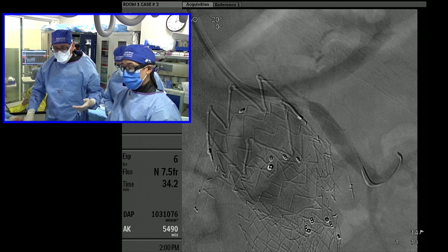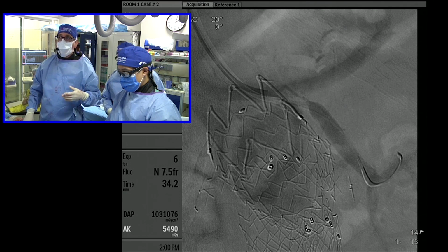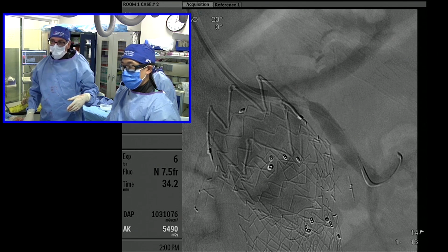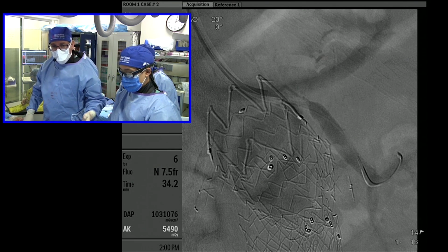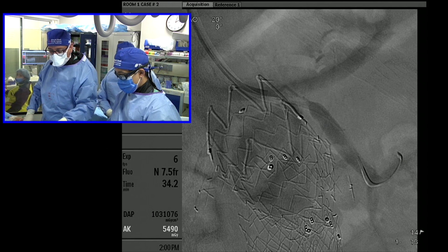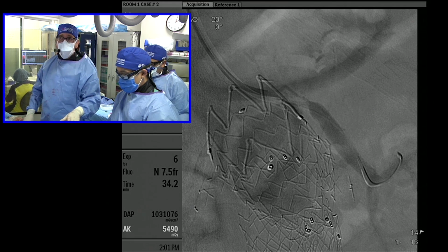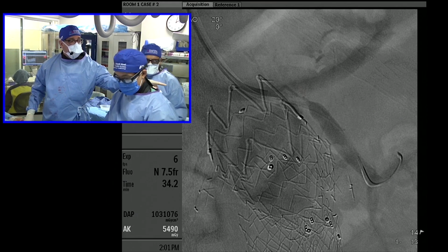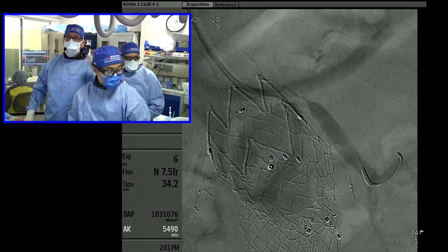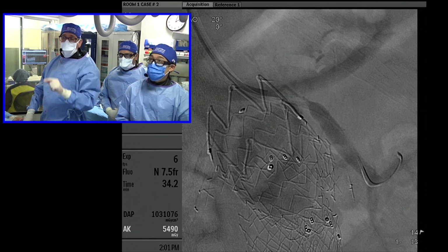And I can show you guys, if you're interested in this setup, how we do FFR for the renal, for transradial approach. If you can zoom in on my fingertips, we have a pressure transducer, which is transducing off the guide cath. And I'm not sure if we can show the Volcano screen here. It's the same as that up there. Thank you very much. But that's the red waveform.